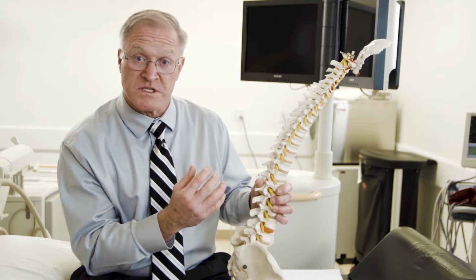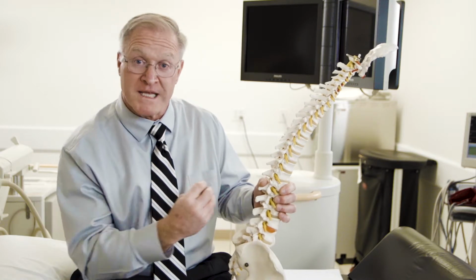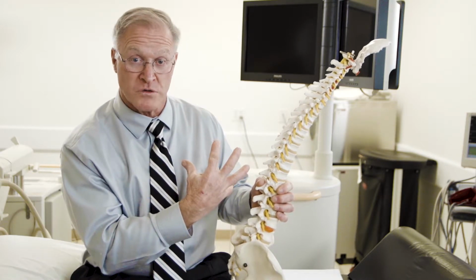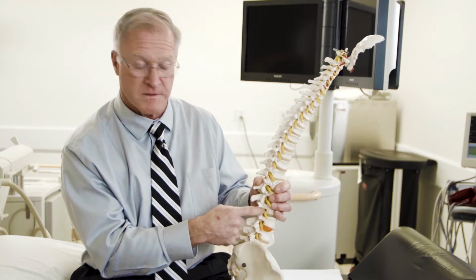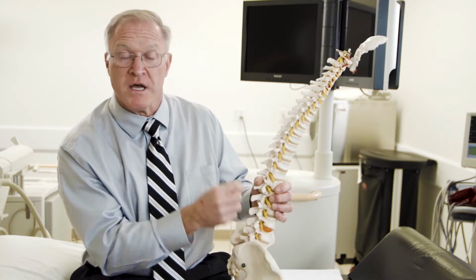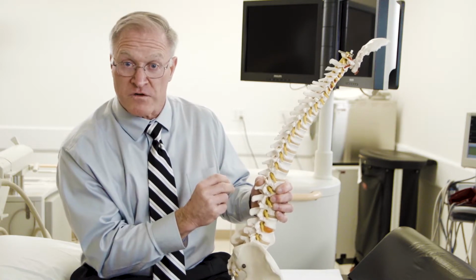I want to also see that medication enter the foramen and go inside the canal if the goal is to do what's called a transforaminal or through the hole epidural steroid injection. If I want to treat just the root, I simply need to see the medication coat the nerve root, and that would be what's called a selective nerve root block.